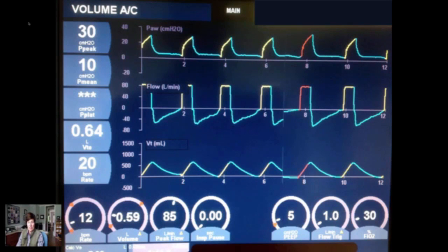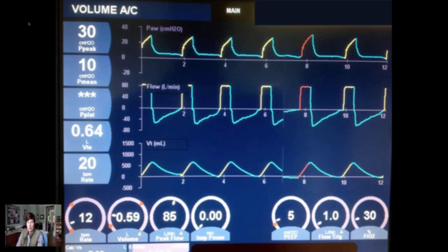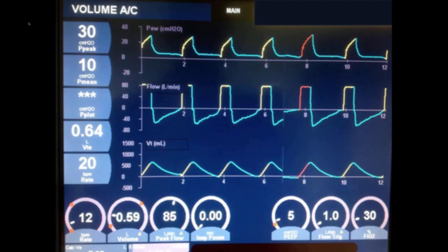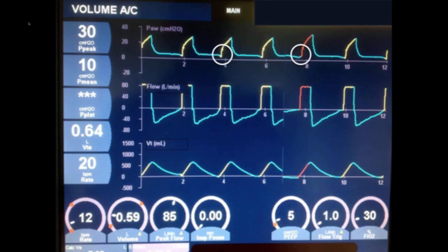Let's take a moment to look at this ventilator and pay attention to the ventilator waveform. We're going to use this graphic to demonstrate the difference between an assisted breath and a controlled breath. You can see in the bottom left-hand corner that the set rate is 12, but just above it the patient is breathing 20 times per minute. To tell the difference in volume assist control between an assisted and a controlled breath, you look at the pressure waveform in the top line. A slight negative deflection shown with the yellow line represents an assisted breath, where the patient has sucked the pressure down to the trigger point and the ventilator has initiated a breath. The patient gets the set tidal volume and the flow remains the same.